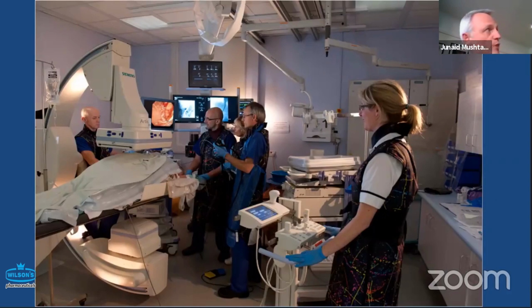Yes, you can take a small biopsy, but do not do a sphincterotomy and do not put in a stent. I would walk away and bring the case to the MDT, because if I'm going to be doing the ampullectomy, I do not want the surgical field altered by a sphincterotomy or a stent. So I would totally agree with you. It's really important to walk away.